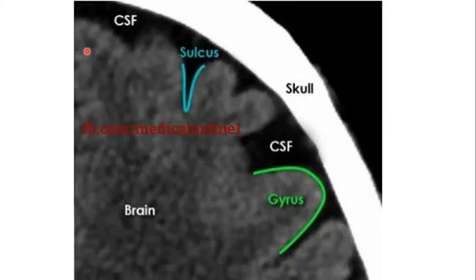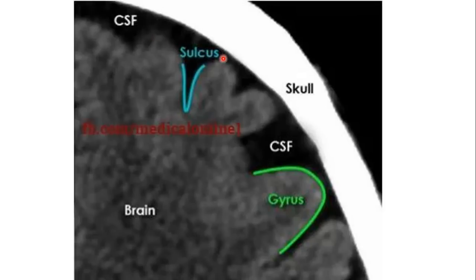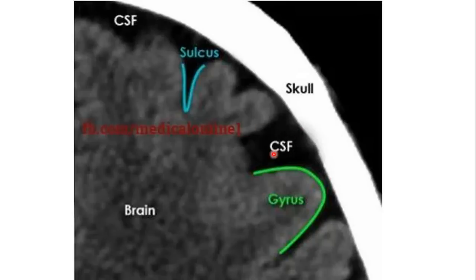On a magnified CT view of the brain, the brain parenchyma shows whitish gray matter on the surface and darker white matter beneath it, due to the myelinated nerve sheaths making it less dense. The pia mater, arachnoid, and dura mater line the inner table of the skull bone but cannot be individually seen on CT. The grooves are sulci and the elevated parts are gyri. The CSF-containing spaces are the subarachnoid space.